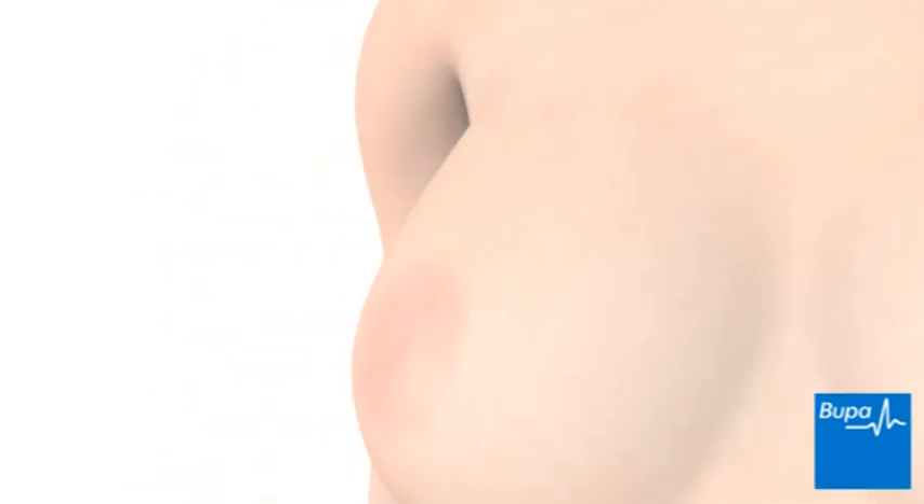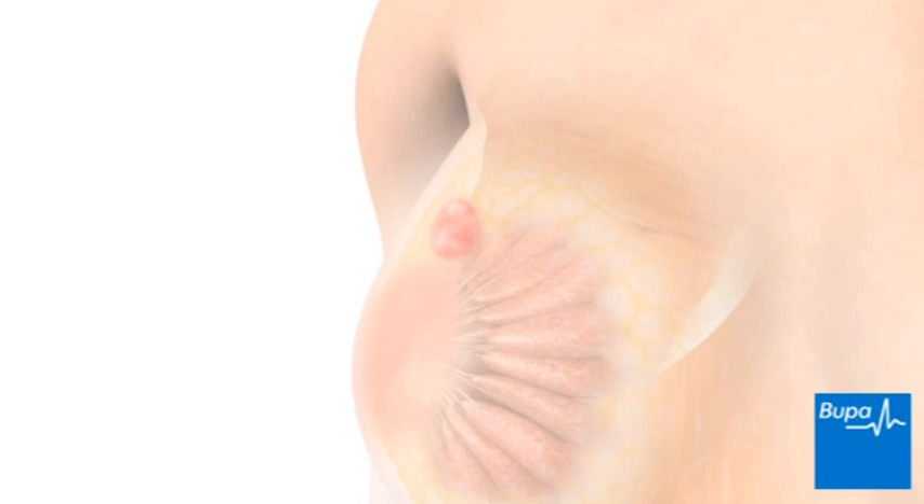A Fine Needle Aspiration is a procedure used to take cell samples from tissue. It's often used to remove cells from breast tissue. The samples are sent to a laboratory for testing.